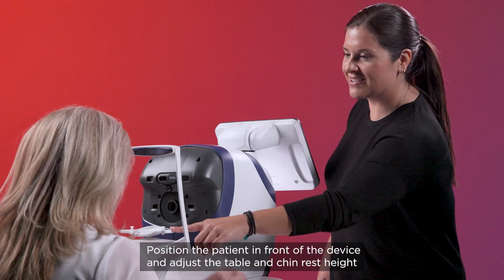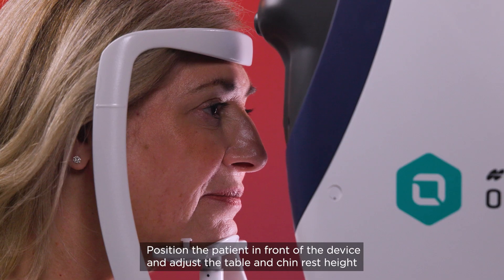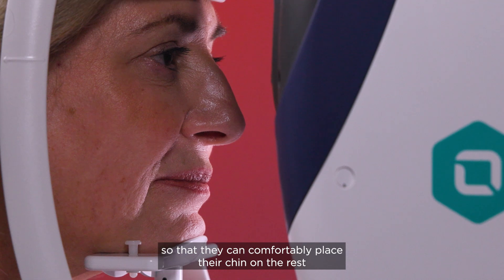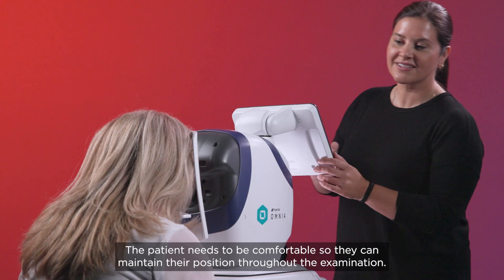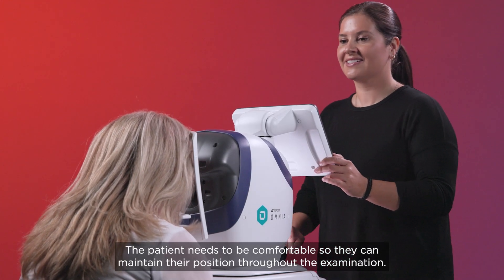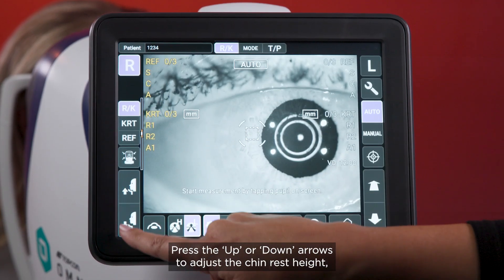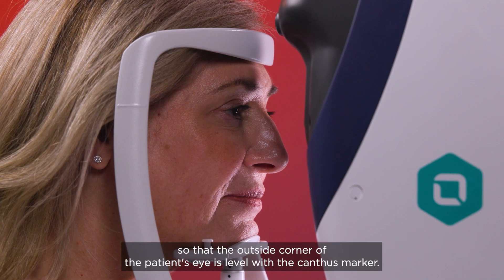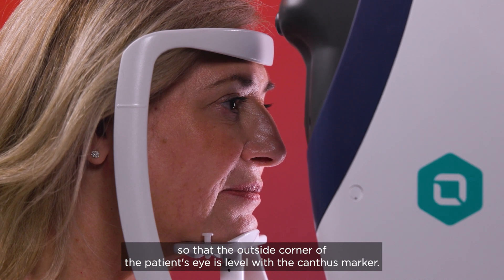Position the patient in front of the device and adjust the table and chin rest height so that they can comfortably place their chin on the rest and their head against the forehead rest. The patient needs to be comfortable so they can maintain their position throughout the examination. Press the up or down arrows to adjust the chin rest height so that the outside corner of the patient's eye is level with the canthus marker.